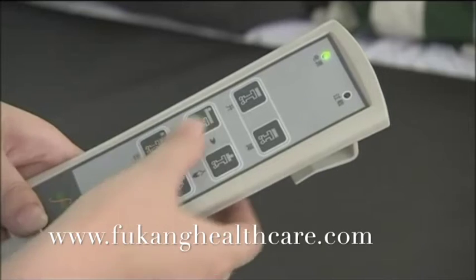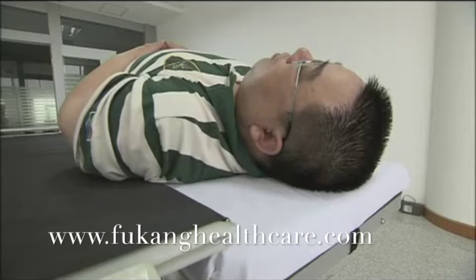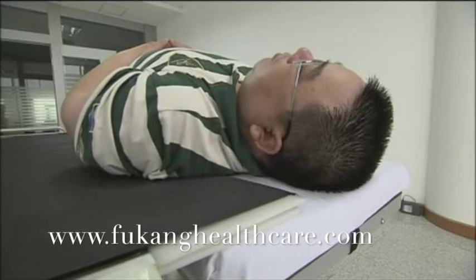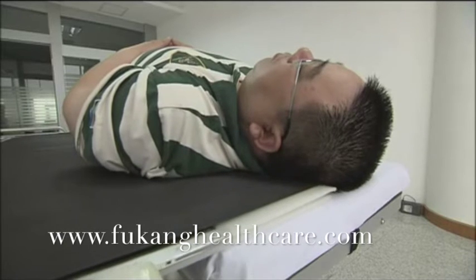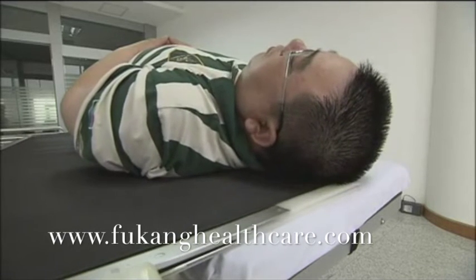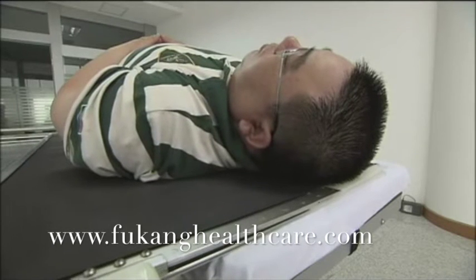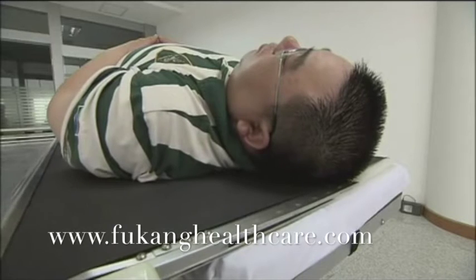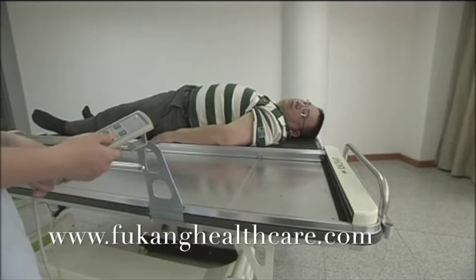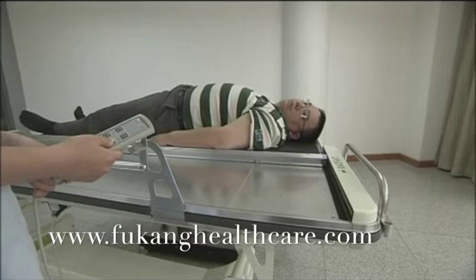Press load. The transfer panel can insert under the body of the patient without any movement. Press in, and put the patient on the transfer vehicle.